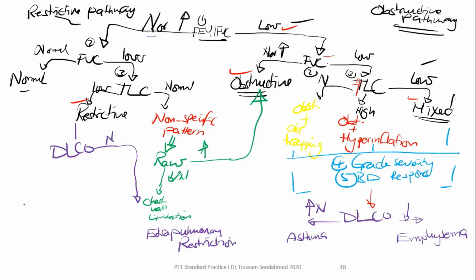طيب الآن عندي restrictive picture with الدلكو طلع لي low. دي طوالي will go with pulmonary or parenchymal restriction. يعني مثلا patient عنده asbestosis, IPF اللي هو كل interstitial lung disease. These will cause restrictive picture with low DLCO.